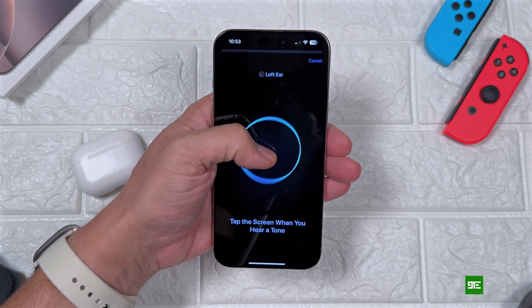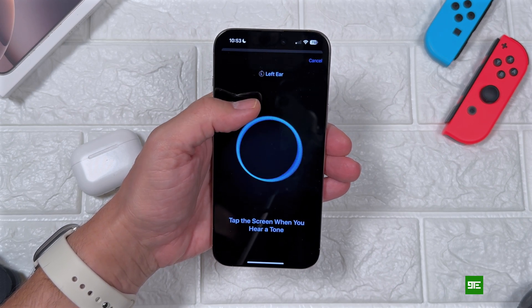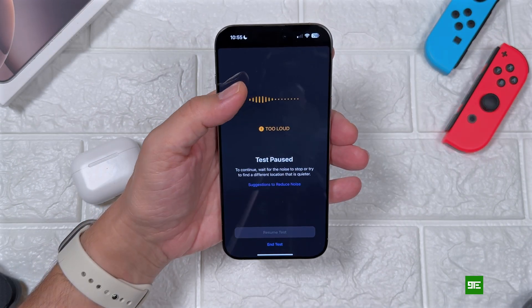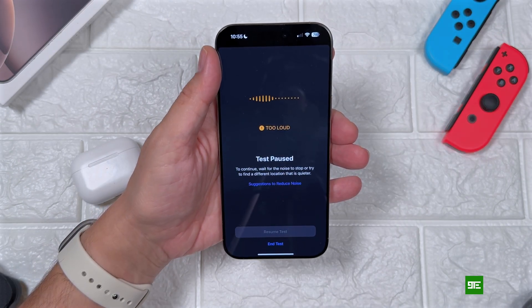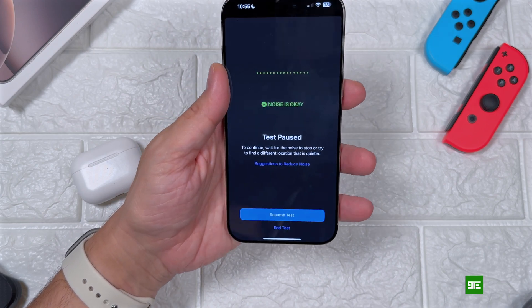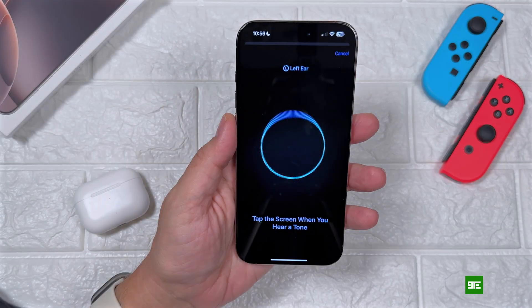So each time that I hear a noise I'm tapping on the screen — this measures my hearing. This works in a similar way as a third-party hearing test. If there's too much noise during the test, you will see an indication on your iPhone, and when things go back to normal you will see that noise is okay.